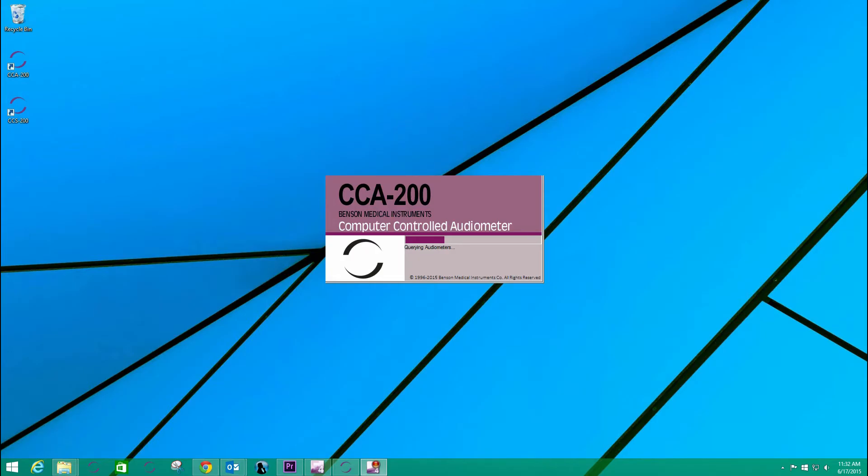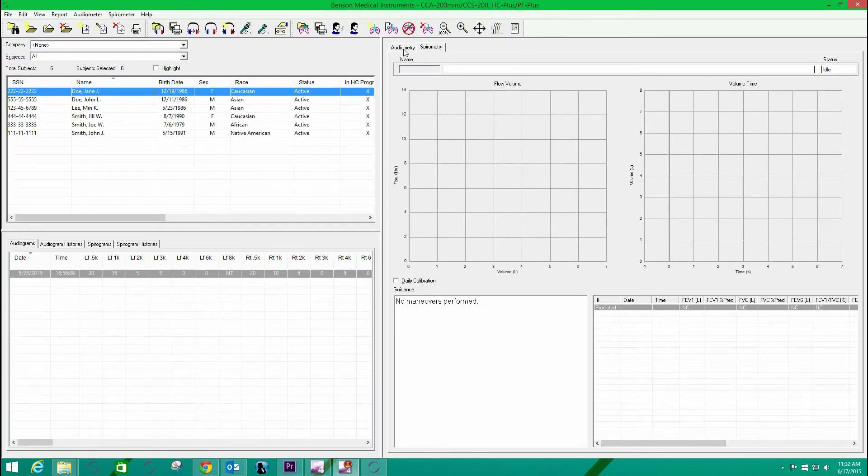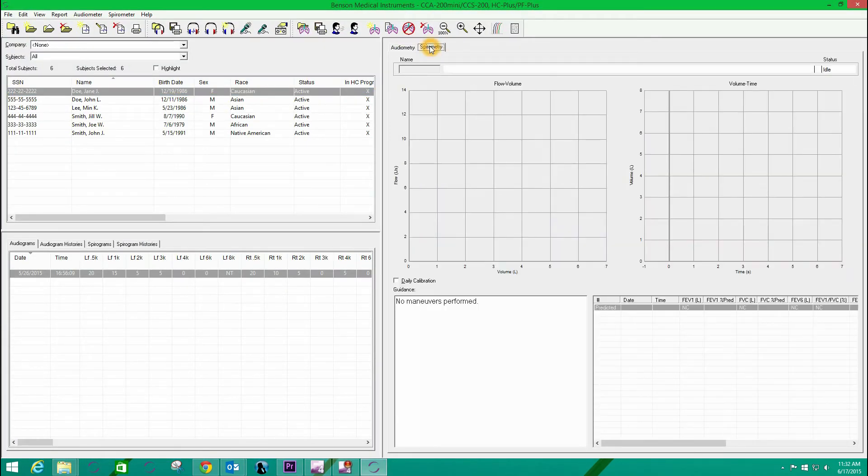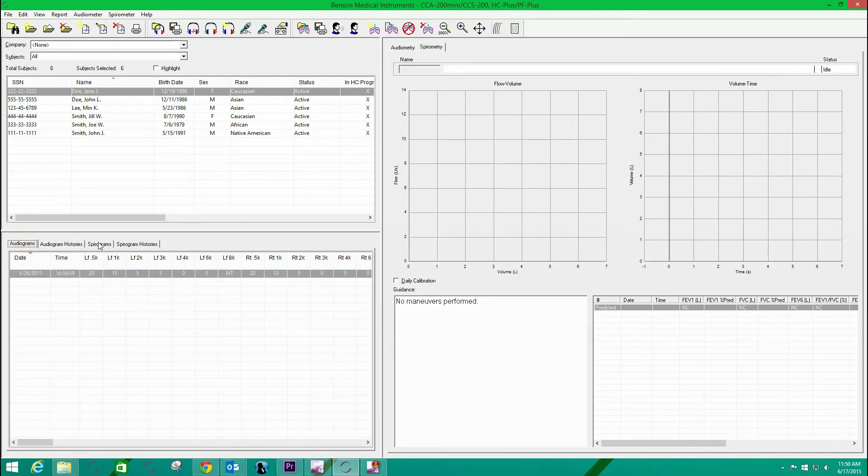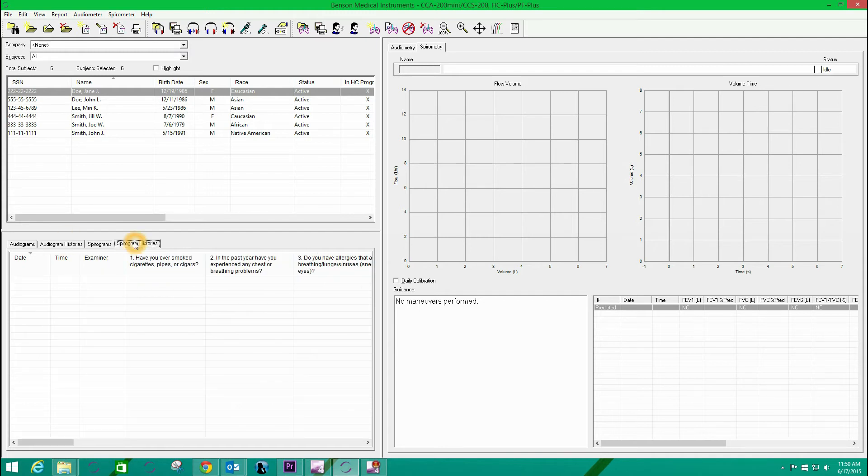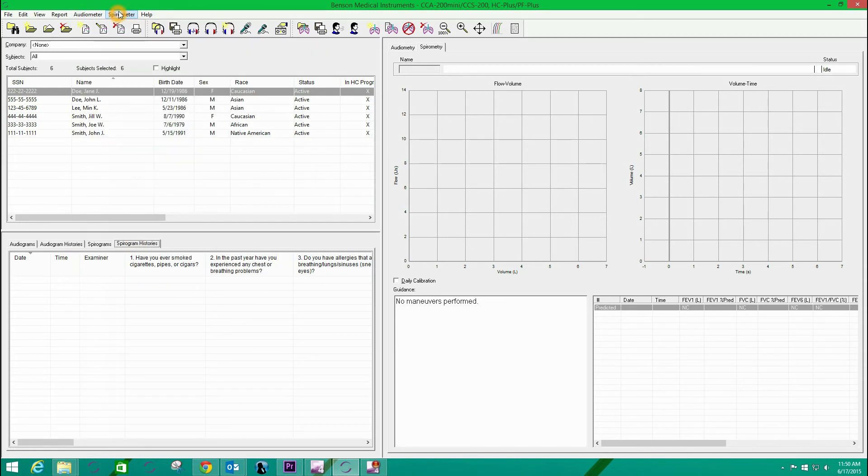Now when the program appears, the audiometer and the spirometer controls both appear in the right pane, and the database view on the left has audiograms, spirograms, and both types of history records. You'll notice that the menus and toolbars have controls for both test types as well.